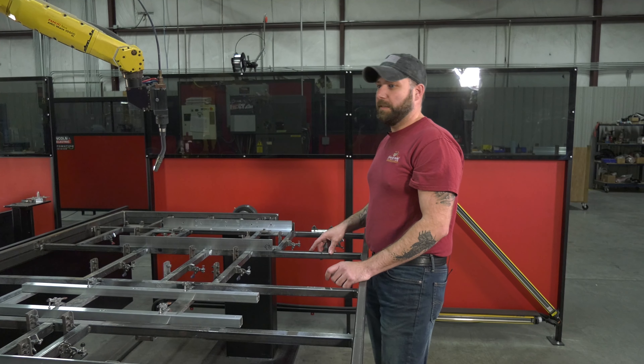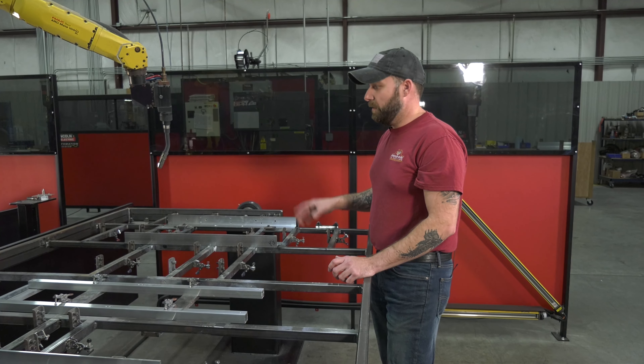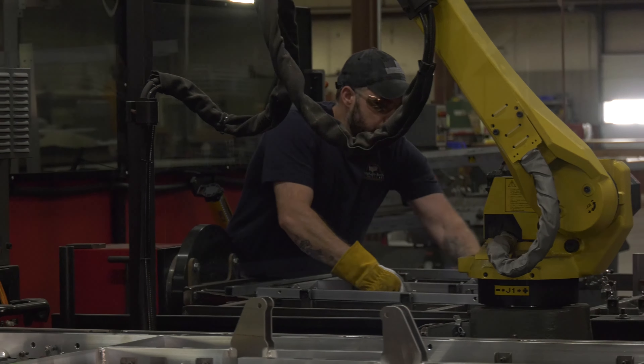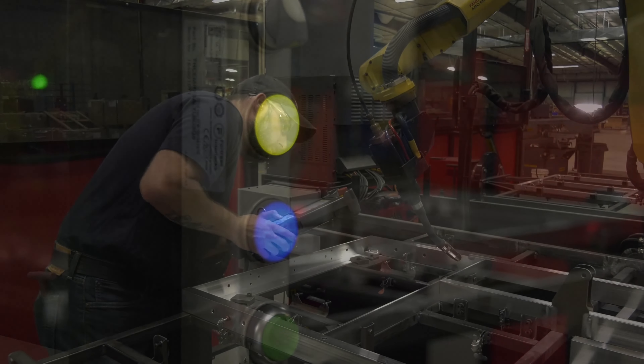My name is Brandon Dawson and I'm the fabricator welder. I've been here for about two and a half years here at SleepSafe. All of our beds start with the welding procedure. We get all of our parts cut in, everything's brought over to me, and I'm the guy that fabricates it and puts it back together. We use an automatic welding system that allows us to precisely weld every single bed.